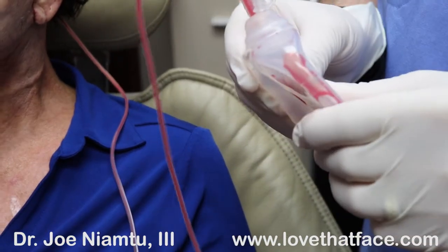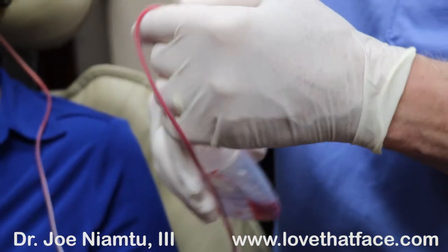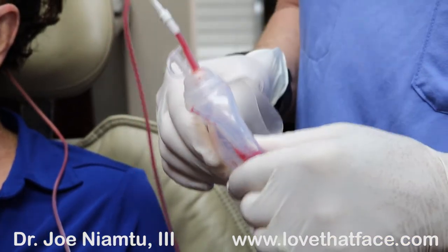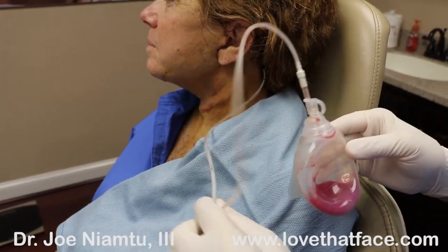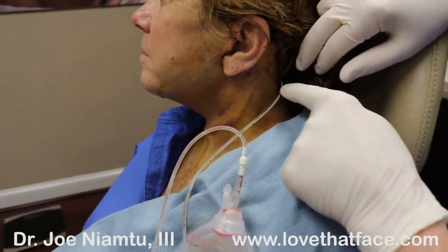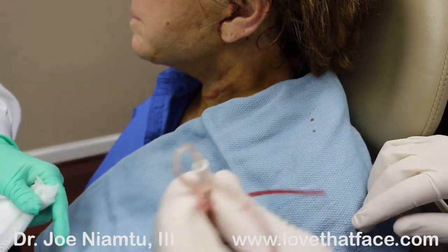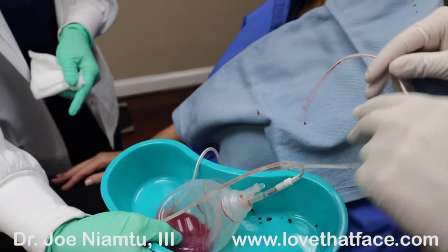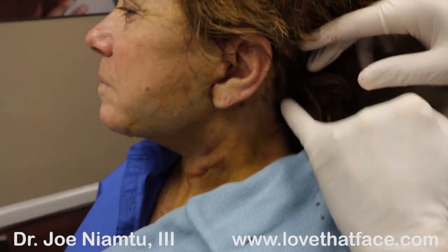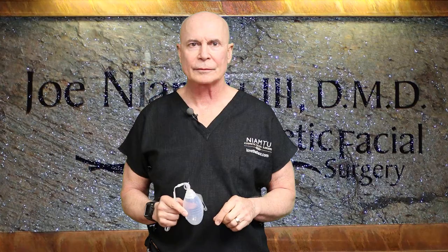We leave drains in anywhere from one to five days depending on how much drainage you're getting, but everything that comes out is something that doesn't stay in the neck, making healing easier with less bruising and a better result faster. To remove the drain, we cut the little suture that was retaining it — it's very simple, you just take it out and the patient won't feel it. Here is the portion that was inside the patient; the last hole of the incision will heal up spontaneously.